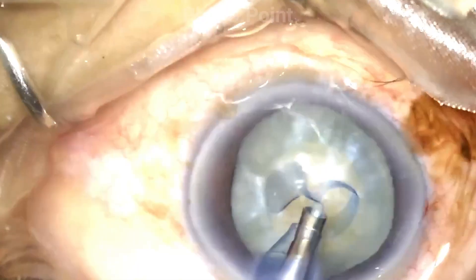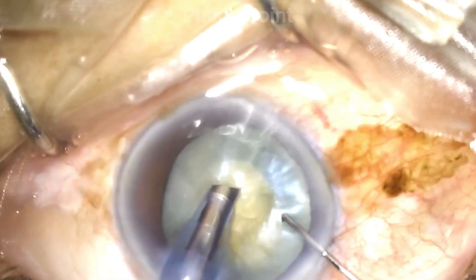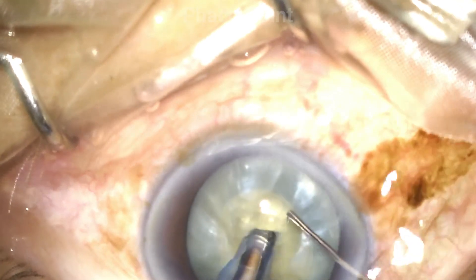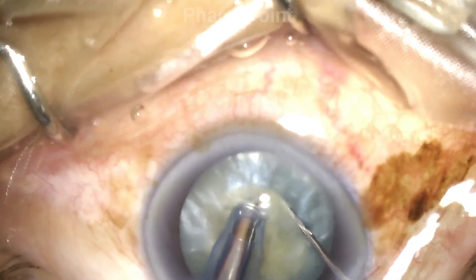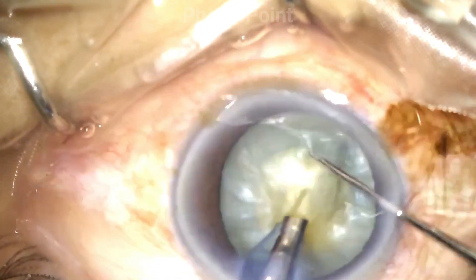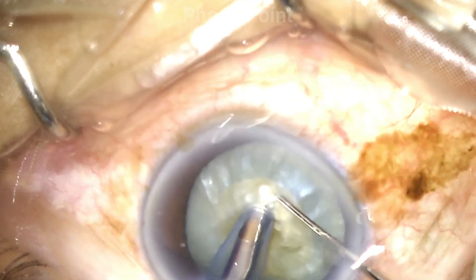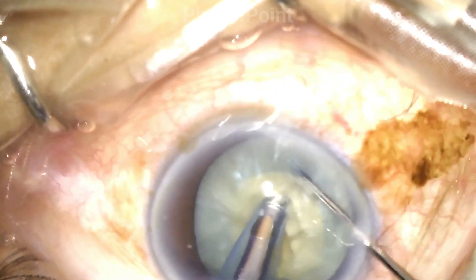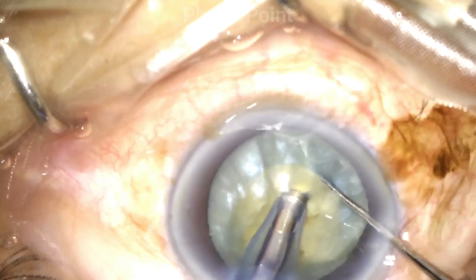I now move to the nucleus emulsification with the direct chop technique. When working with a small rexis, we need to be mindful that we do not accidentally damage the capsulorexis edge during the direct chop procedure. The way to do so: first, make sure you stain your capsule very well so that the capsulorexis edge is always visible during surgery; and second, all instrumentation during the direct chop procedure should occur within the central zone, that is within the capsulorexis itself.